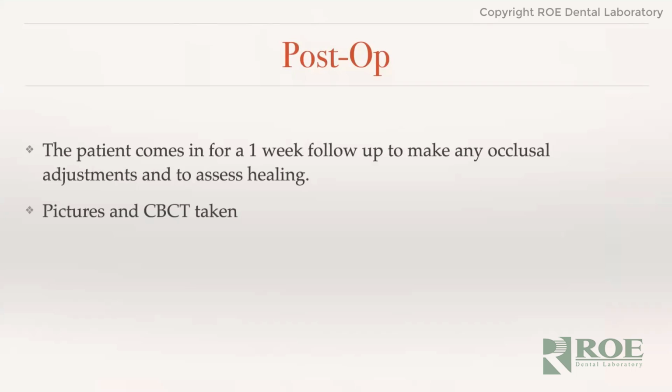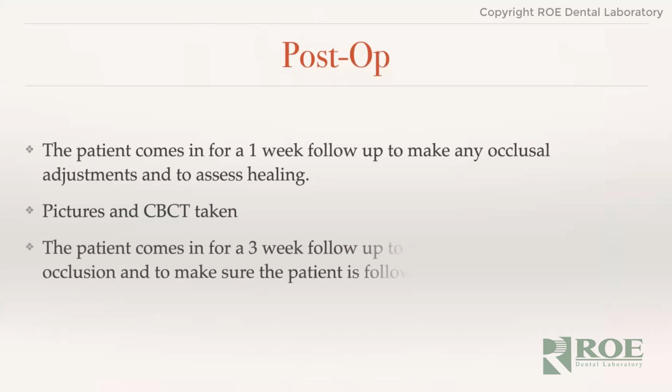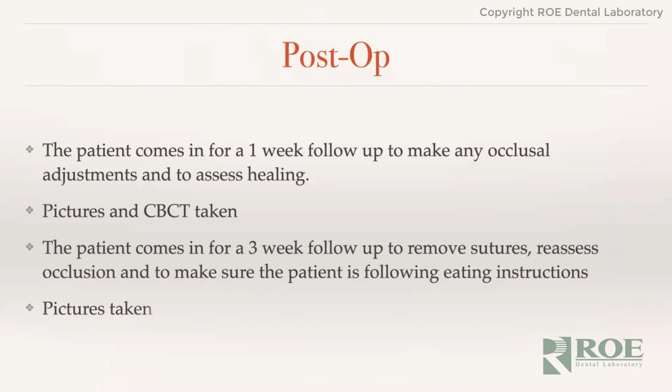We're going to take pictures. Since they were under sedation, we don't take a CBCT at that appointment. The patient comes in for a 3-week follow-up to remove any existing remaining sutures, reassess the occlusion, and make sure the patient is following all the correct eating instructions. And then we'll usually take a set of pictures after that.